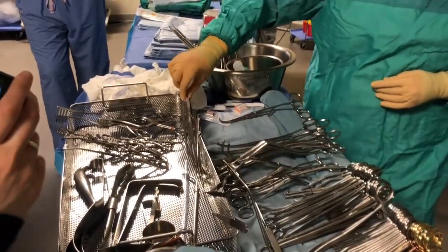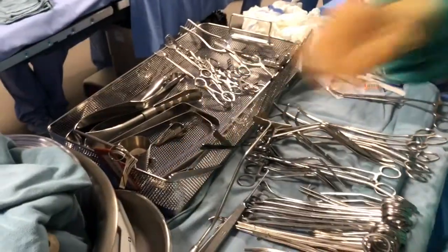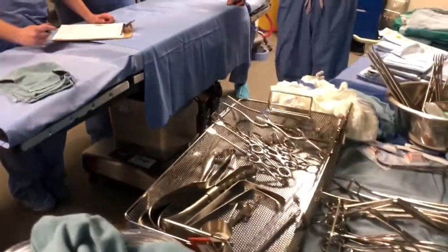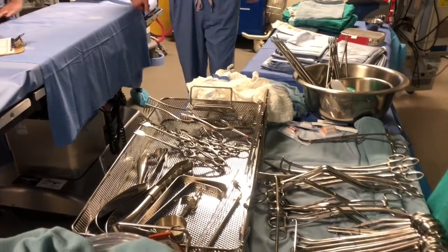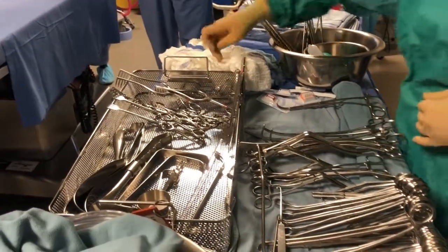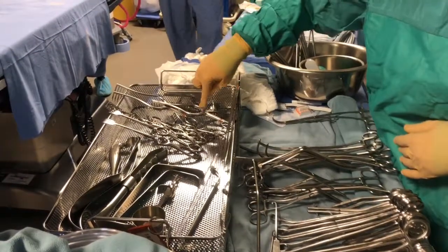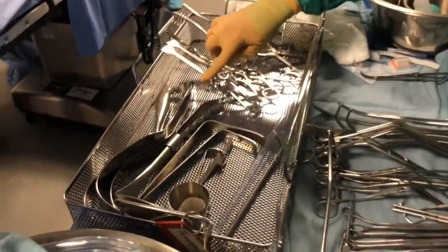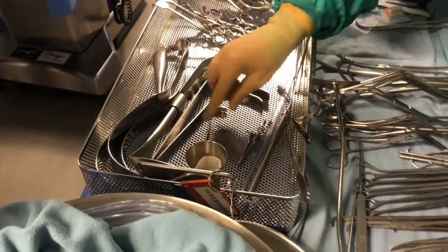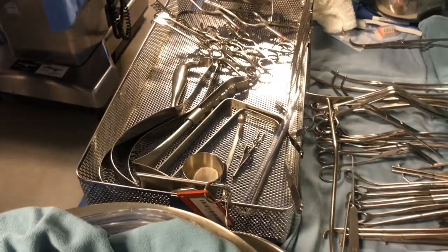And we'd go 1, 2, 3, 4, 5, 6, 7, 8, 9. So you don't separate them non-tooth and tooth? Nope, they're counted all as tissue. And then retractors are counted all together as well. So there's 1, 2, 3, 4, 5, 6, 7, 8, 9, 10, 11, 12, 13, 14, 15, 16, and 17. There's 17 retractors.